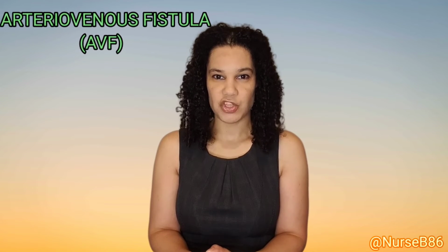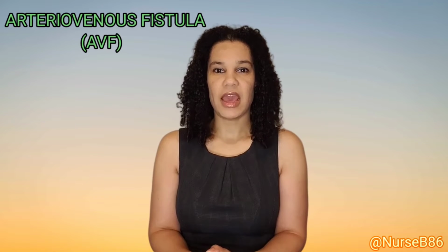Typically, this is done at a hospital, at home, or at a satellite unit or outpatient clinic. This involves plastic tubes connecting you to the dialysis machine via a device that is necessary for good blood flow. These devices are referred to as access, and there are 3 different types. In no particular order, the first type is arteriovenous fistula or AVF.